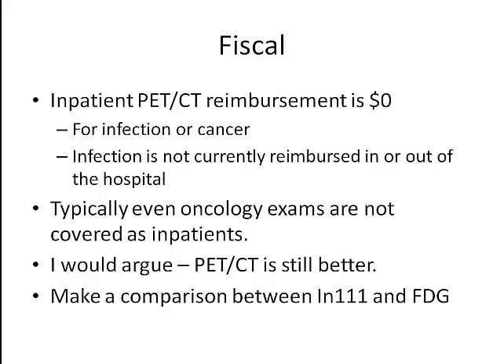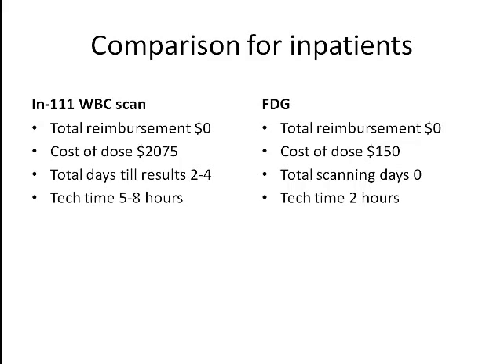It was a big struggle for me. Our PET scanner is very busy. If I'm adding a patient, I typically have to have an explanation of why. Cardiac PET is reimbursed, oncology is reimbursed, it's all understood. But when I go to my hospital leaders, I have to explain why. So I would argue that PET-CT is better, and this is the argument I used, to make a comparison between indium-111 and FDG. I'm never really worrying about money, but I do worry about resources, and I want my departments to run efficiently.